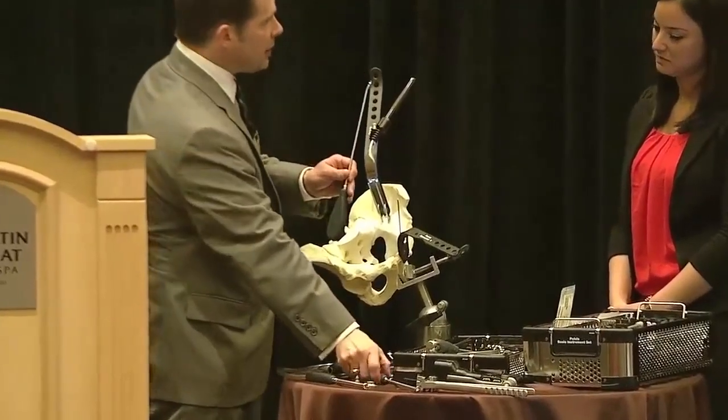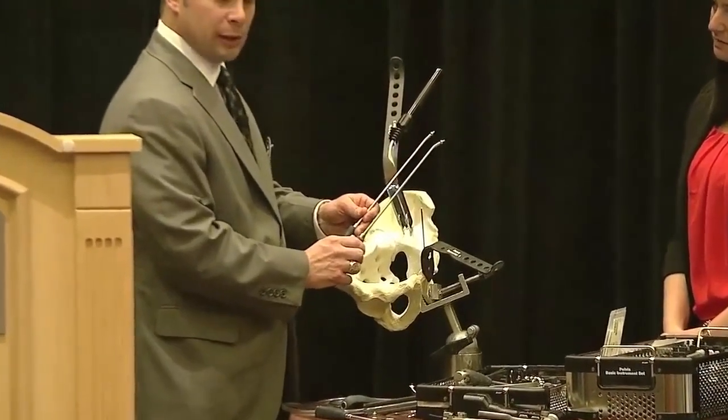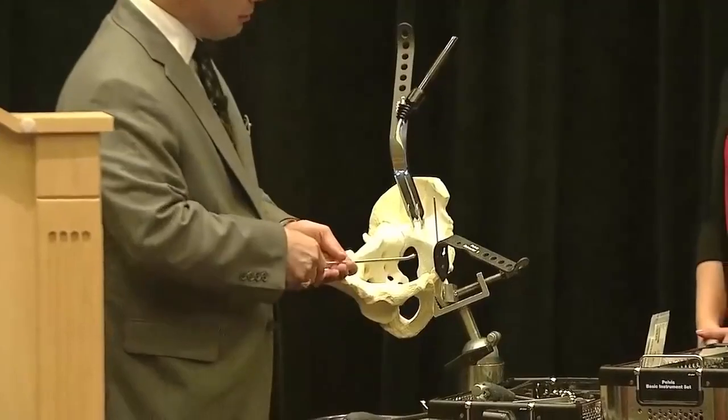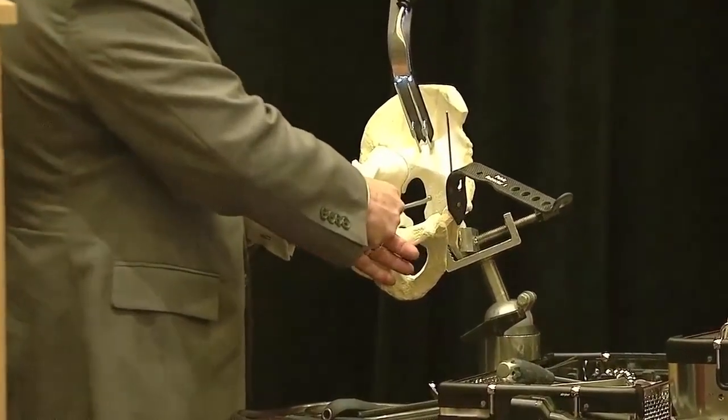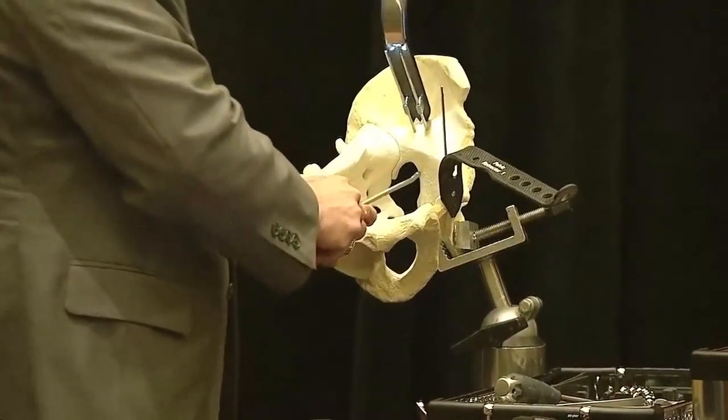This is a 15-degree angled picador. There's a 30-degree angled picador or ball spike. And we use these to move fragments around, like to reduce the quadrilateral surface. We'll come in at an angle, and we can lift up the posterior column.